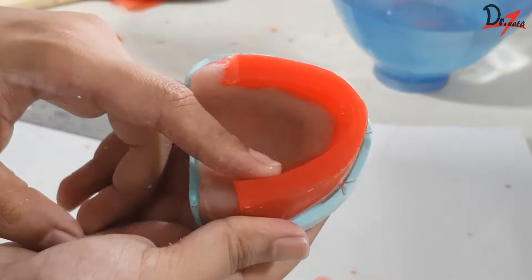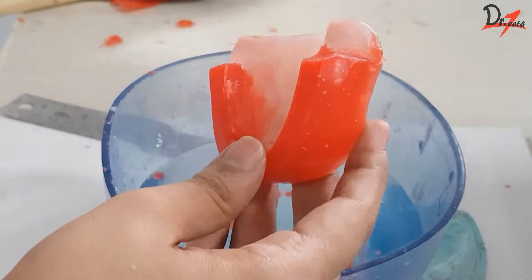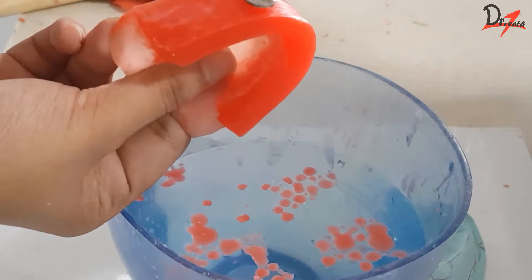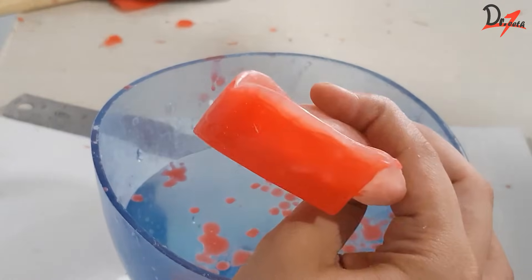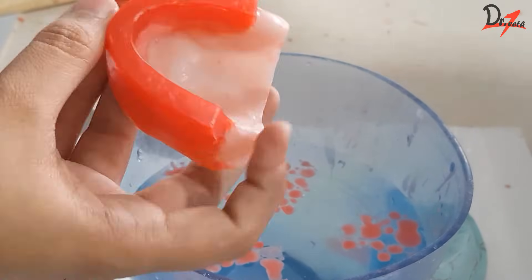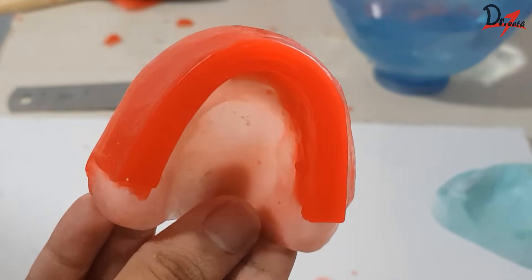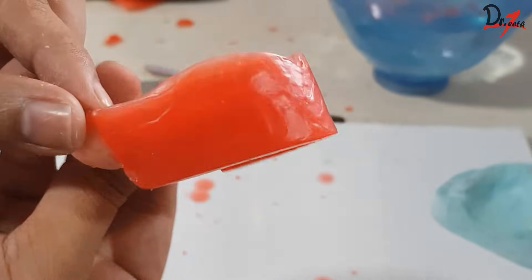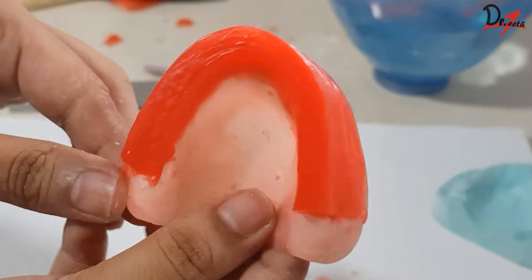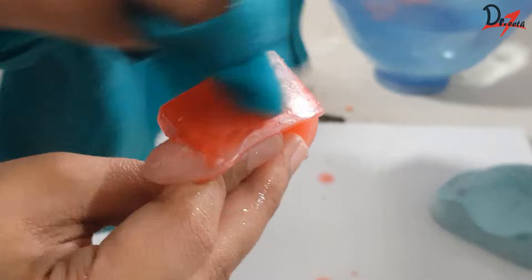I found some extra thickness in the right premolar region so I'm going to reduce that. We can decrease the width of the rim throughout if needed, then smoothen up all the areas. As you can see we have got the proclination we needed and we have also started getting a smooth surface. Now we have to check the width of the rim all around and make it smooth and shiny — there are various techniques you can use to achieve this. Here I'm using a thick cloth to smoothen the surface; you can also use a Lecron carver and shave off the surface.